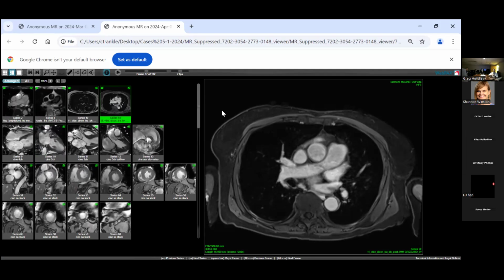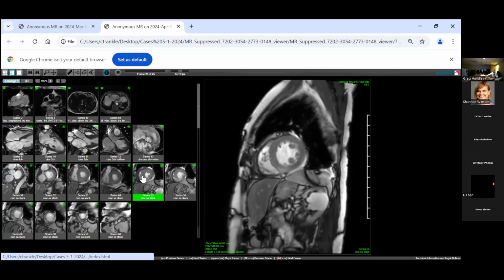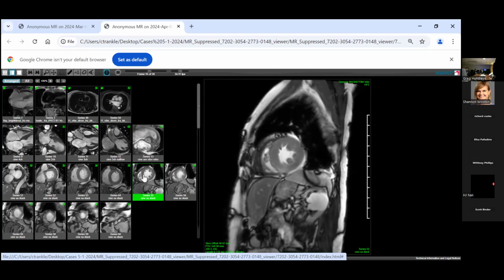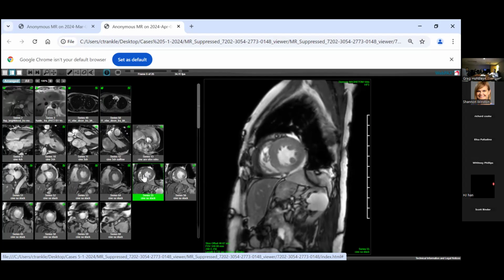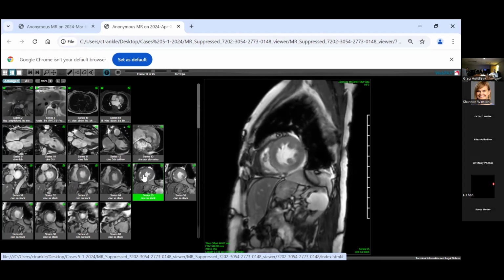Well, in cardiovascular medicine, we've also got to be able to assess function. So Corey, can you click on this picture? Now look on the right side of the screen, and you've got a movie. How do we go from making, as we talked about 2 weeks ago, a static picture, to making a movie, which is a whole series of pictures playing together?